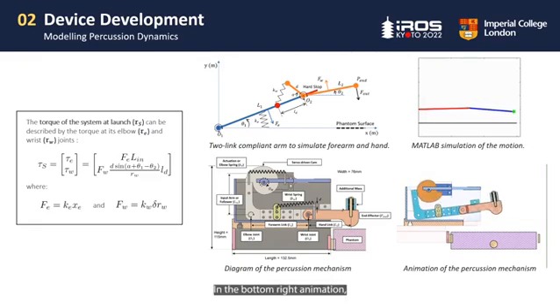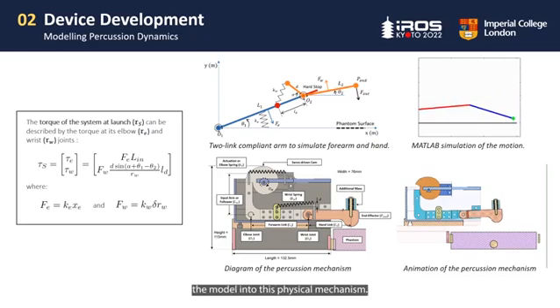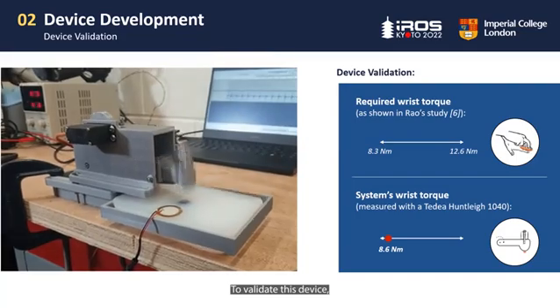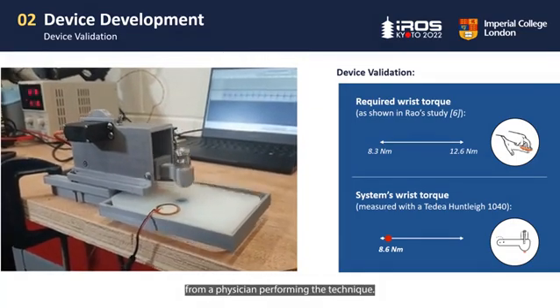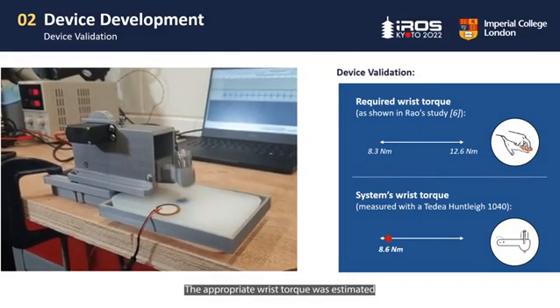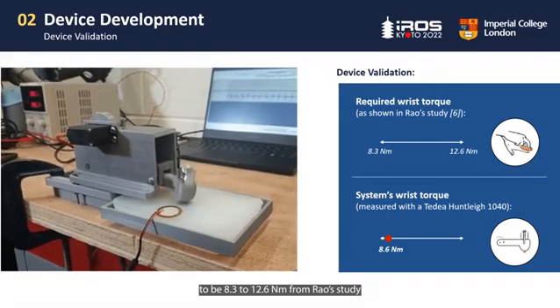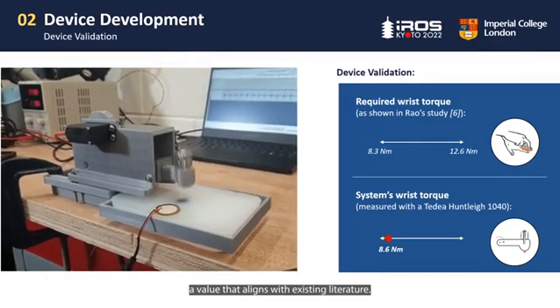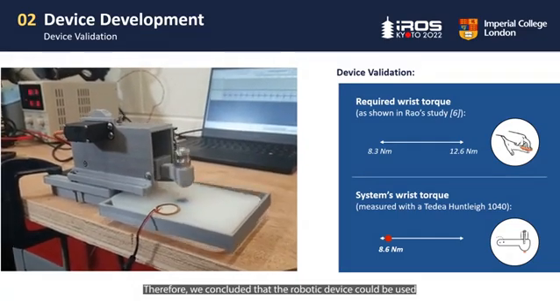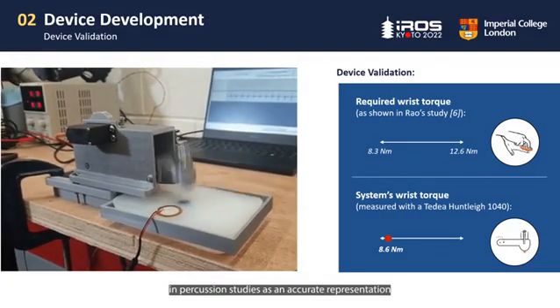In the bottom right animation, you can see how we translated the model into the physical mechanism. To validate this device, we compared its impact force to what is expected from a physician performing the technique. The appropriate impact torque was estimated to be 8.3 to 12.6 Nm from Rouse's study, and the device torque was 8.6 Nm, a value that aligns with existing literature. Therefore, we concluded that the robotic device could be used in percussion studies as an accurate representation of a physician's percussion technique.